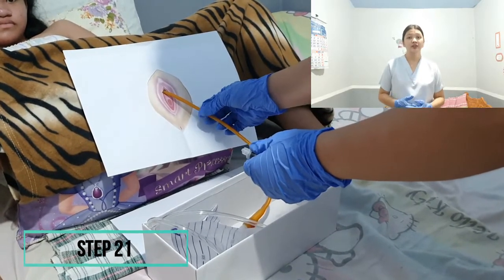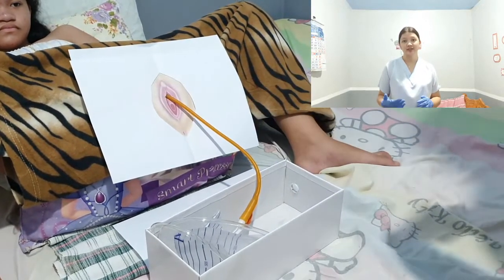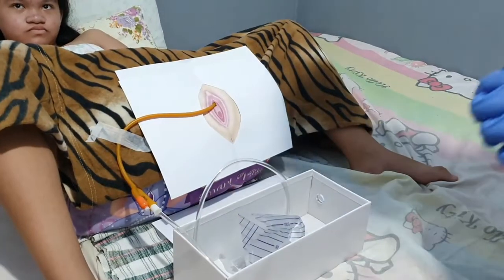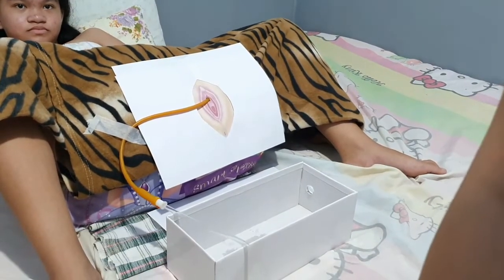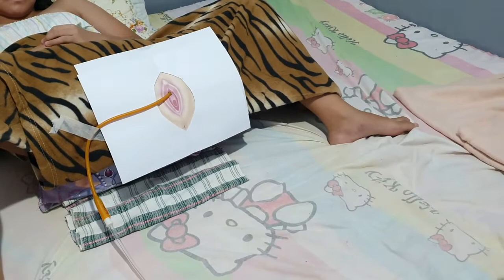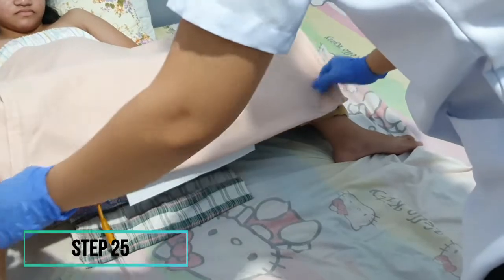After inflating, we're going to pull the catheter gently until we feel resistance and advance it again. Connect the urinary bag to the catheter using sterile technique and secure the catheter to the patient's leg using a securement device. Then attach the urinary bag to the bed. Dispose of the supplies we used following agency policy. Cover the patient using a blanket. Remove gloves and perform hand hygiene.